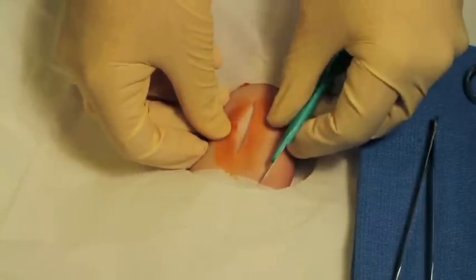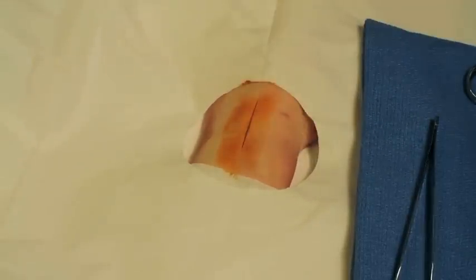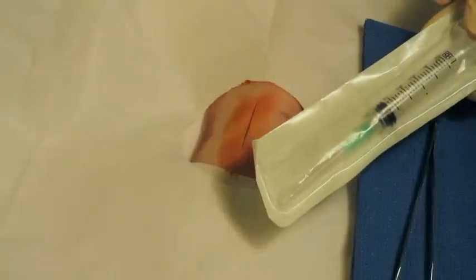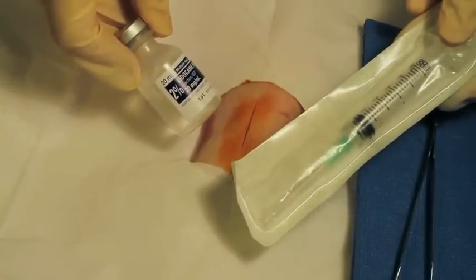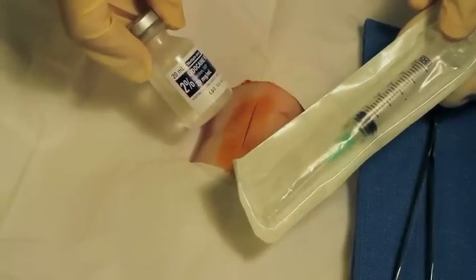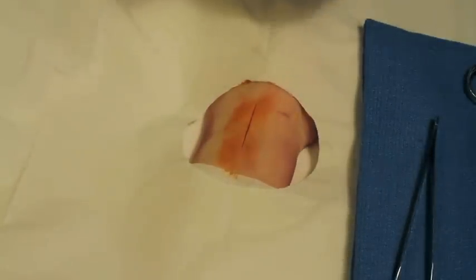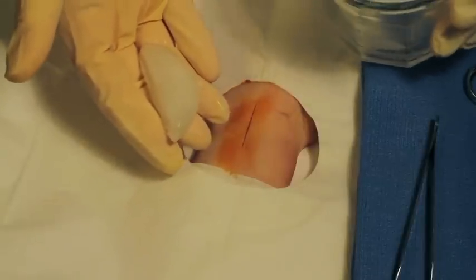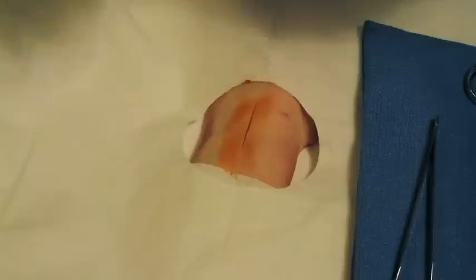What you're looking at there is the dermis, which I'm separating out a tiny bit, and below it you'll see some tendinous material like you would see perhaps on your wrist — as a matter of fact it looks like a child's forearm. Now of course we're going to want to apply a little anesthesia. If you're lucky enough to get a prescription for lidocaine, two percent or one percent would be fine, and you need a small syringe — three to six milliliters would be fine as well. If you don't have it, use some ice and just place it on the cut to help numb it.